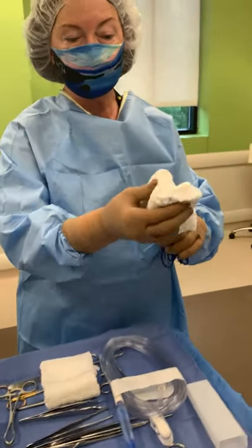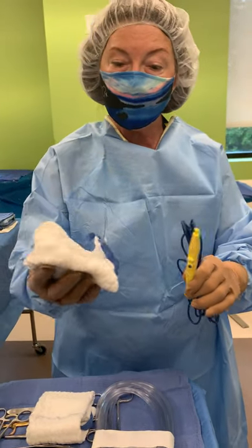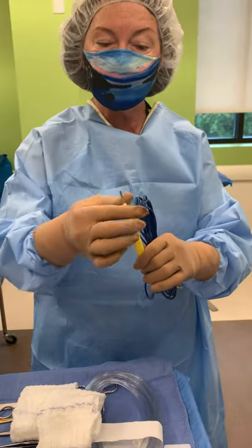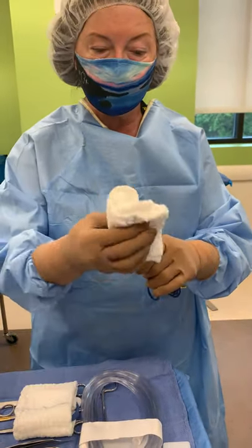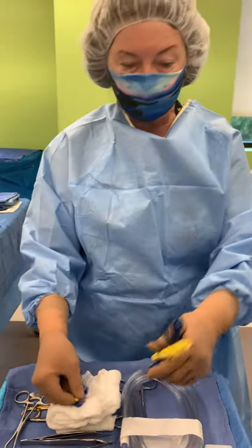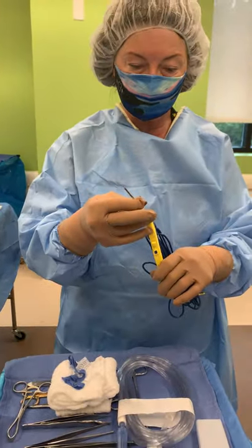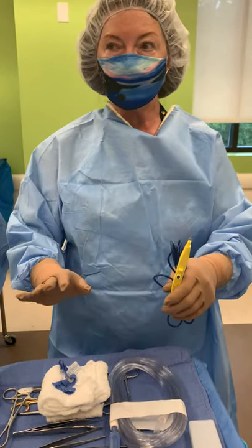So if you have a teflon tip, and when you do switch out the tips, you want to use a lap sponge or something similar — you don't want to use just your fingers because you might poke a hole. So if we're going to remove it, I'm going to remove it like that and then put in the teflon tip. But I'm just going to put it back for now — that's the first thing to know.